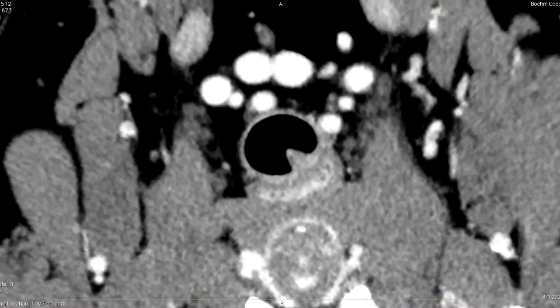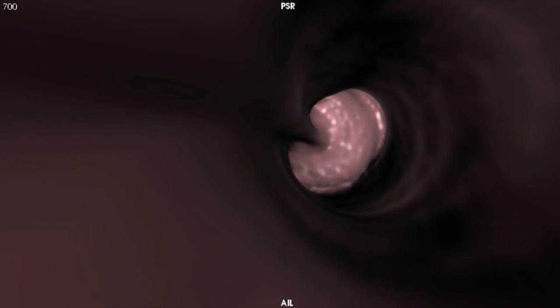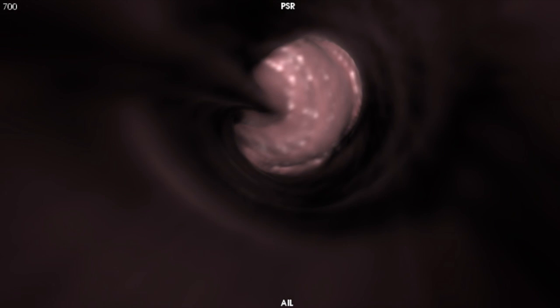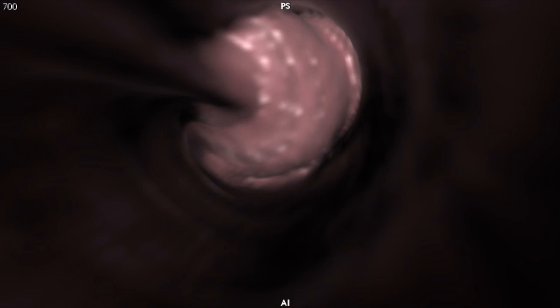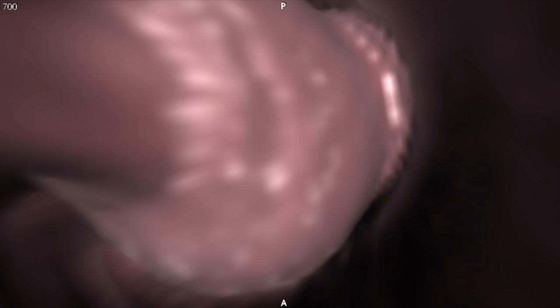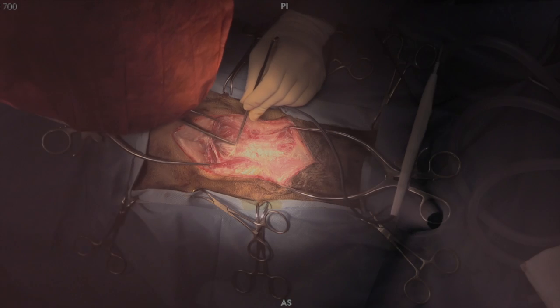This CT scan shows the mass in the middle of the lumen. Now we have a fly-through which shows the camera inside the lumen on a virtual endoscopy. We're just passing the tumor at this point and then into the endotracheal tube.